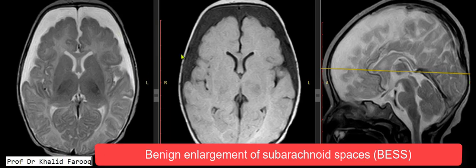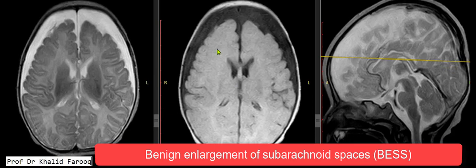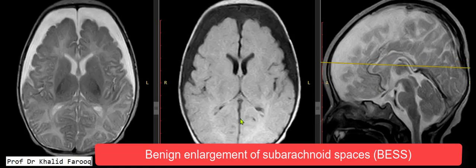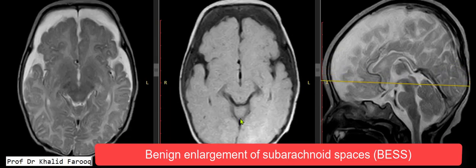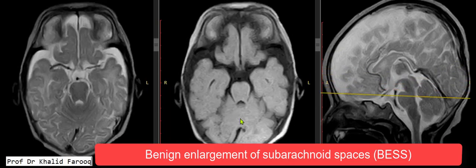This is axial FLAIR and this one is the axial T2-weighted sequence. Here we have the sagittal T2-weighted sequence. We can see there is mild enlargement of the subarachnoid space around the temporal lobes anteriorly as well.